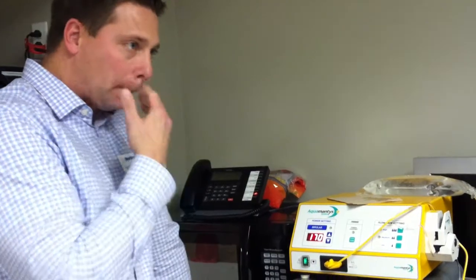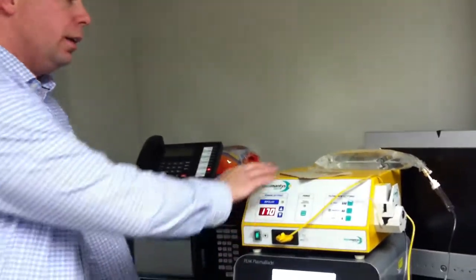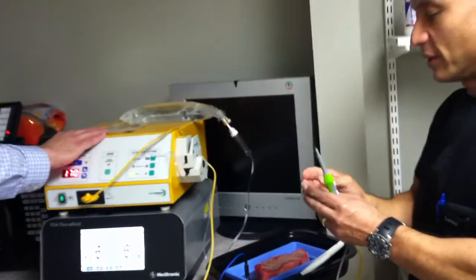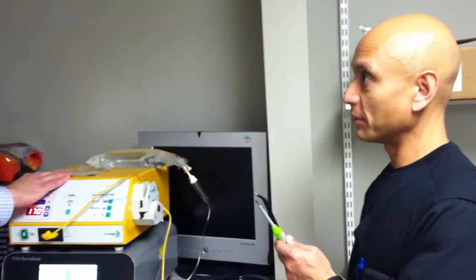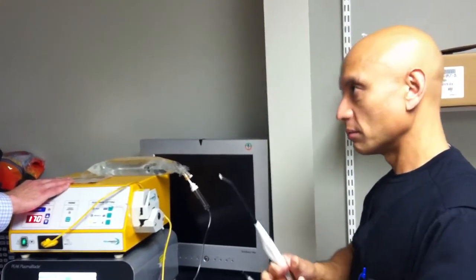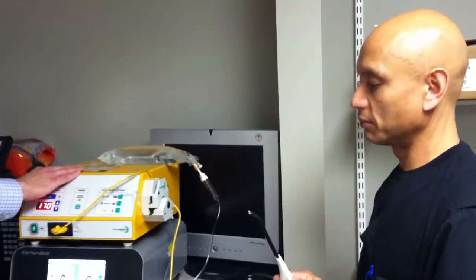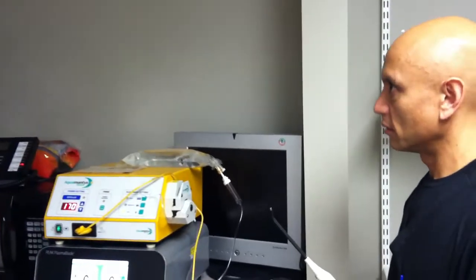Yeah, but just talk about the energy, because that's what we're dealing with. We're using energy to alter the tissue. So the way this does it, it seems like it uses less energy, and it's a very wide surface area compared to a Bovie. Yep. So it's about 1 millimeter penetration, broad, low energy, denatures the proteins, and somehow gets it to coagulate, I guess. Well, the saline also cools, but it conducts.